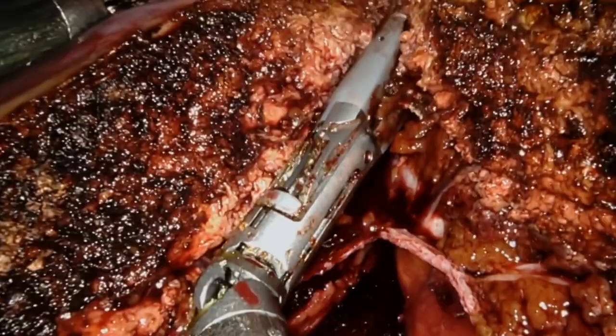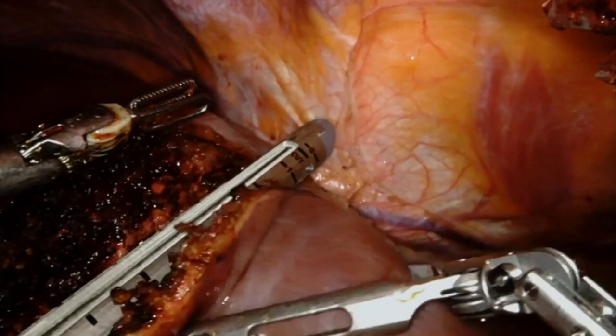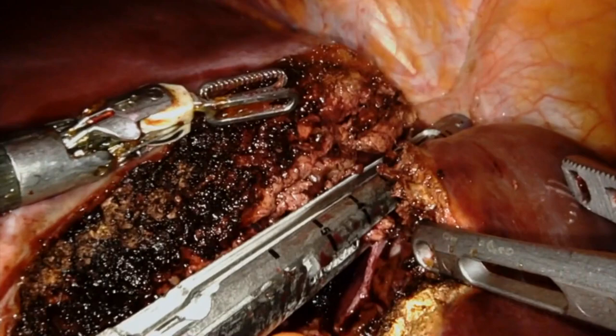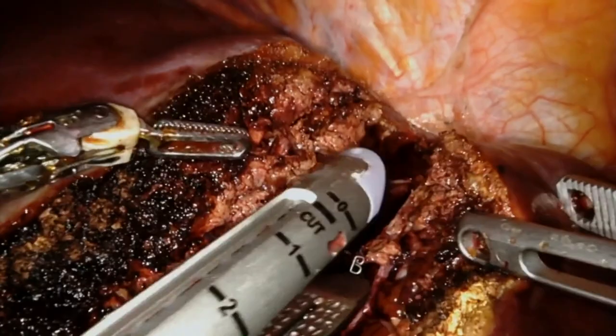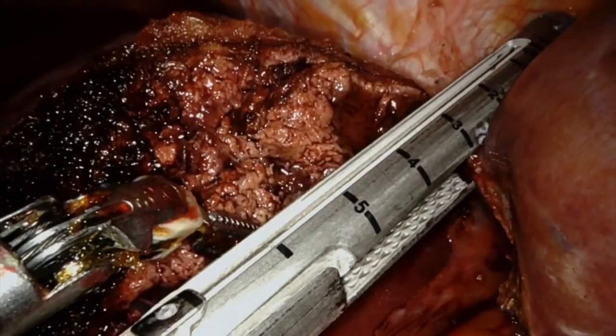Minimal bleeding was seen during this liver transection. The vessel sealer was again utilized to transect the superficial liver parenchyma to expose the stump of the left hepatic vein. A second linear vascular stapler was fired to transect the left hepatic vein flush to the inferior vena cava along the arantius ligament. A third stapler was then fired to finish off the liver resection in a very bloodless manner.